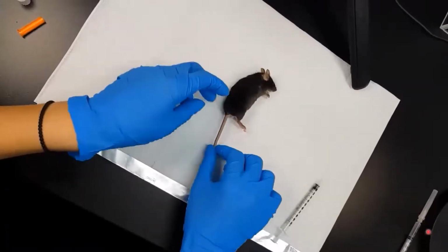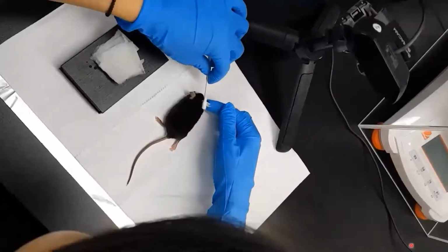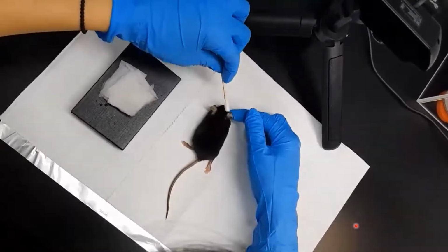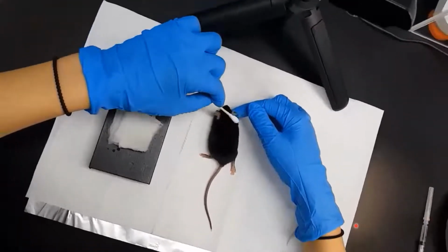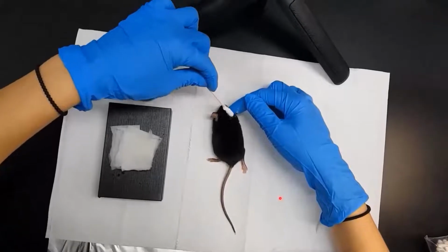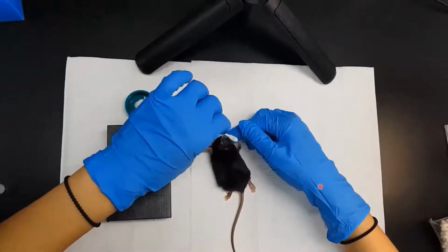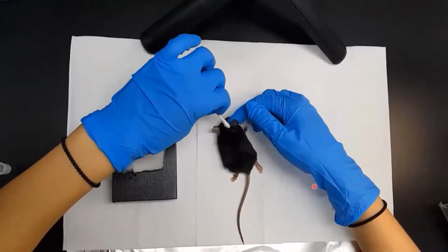And then after injecting the dye, the imaging area of the ear skin was shaved with hair removal cream to prevent visualization of high autofluorescence signals from the hair. So apply the cream evenly to fully cover the hair on the ear skin. And after about 3 to 4 minutes, gently remove the cream and clean it with saline.